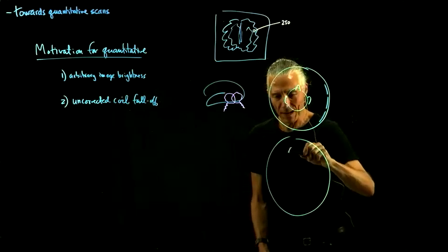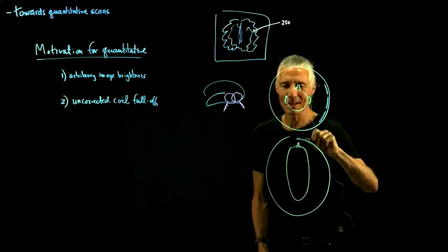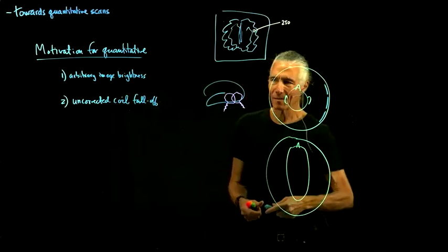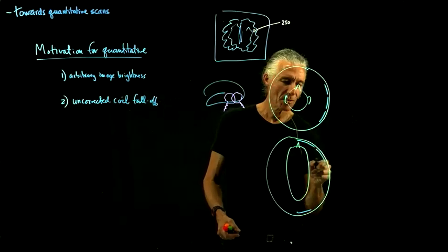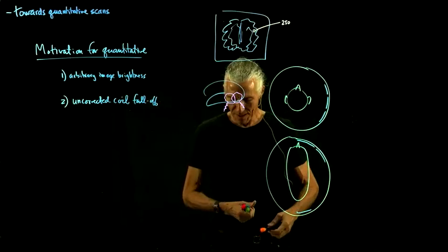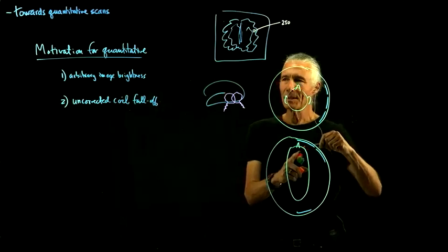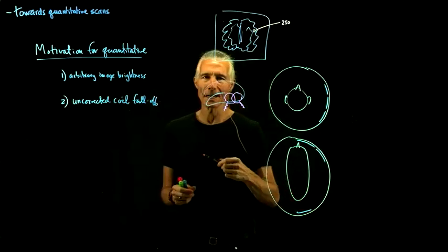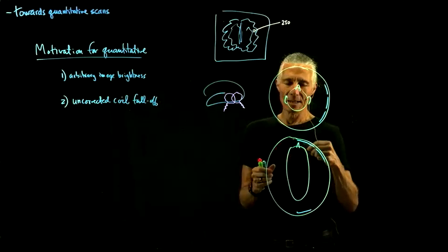When I go in the magnet, I run into the top of the coil, and the back of my head can be pretty close to the coil. In a situation like that, the brightness of the image when you get close to the coil will get a lot brighter. We're talking like 100% brighter or 200% brighter, like 2 or 3 times.